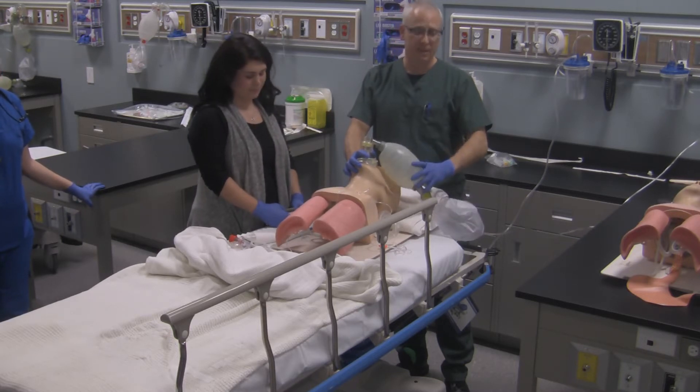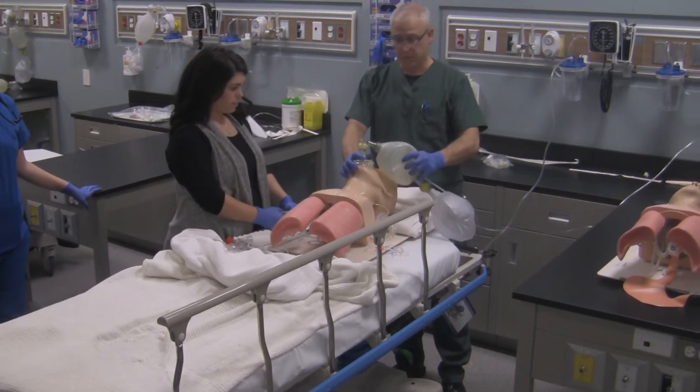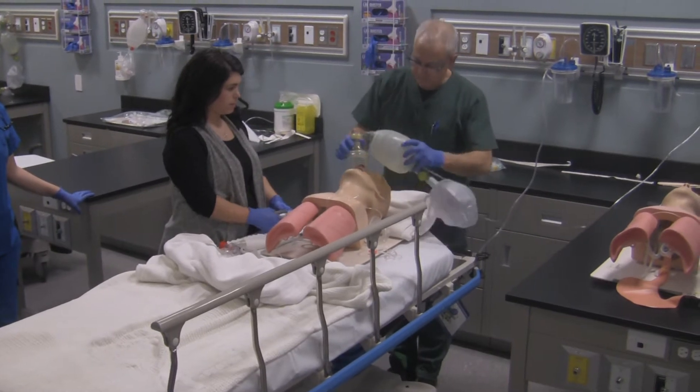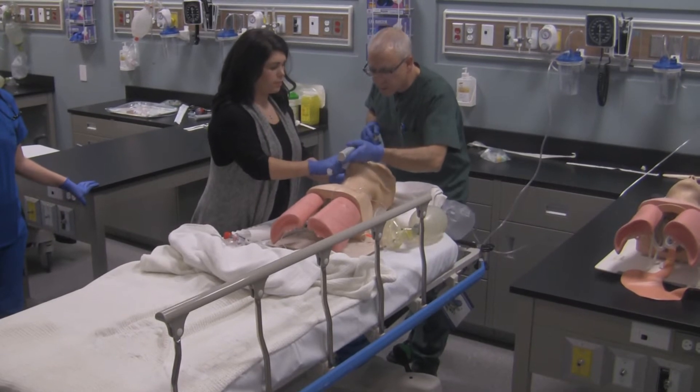So it's been one to two minutes. The other way of going in is to use laryngoscopes so you can visualize the laryngeal structures internally. Mask off — Donald, the plastic thing's coming out. I'm going to give you some of this spray. I'm going slowly and gently.